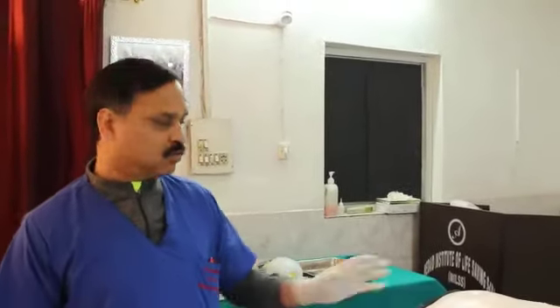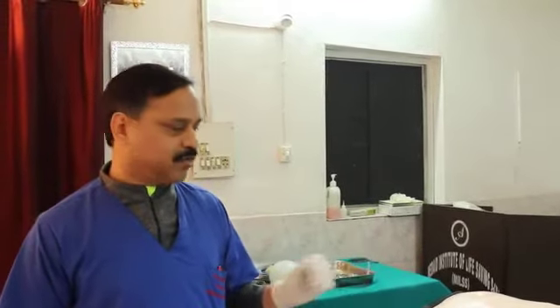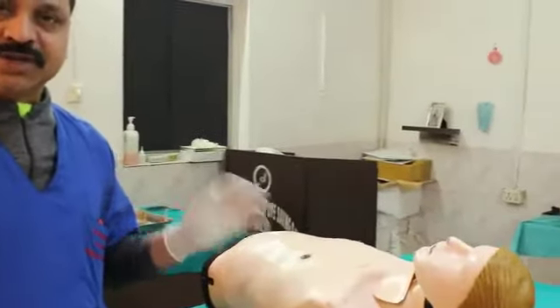Welcome to Worm Medicine Hub. I am Dr. Amar Chohan and today I am going to demonstrate how to insert ICD on Worm Manikin. Worm is the first Indian company to design and manufacture surgical mannequin for trauma training. It has got certain special features.